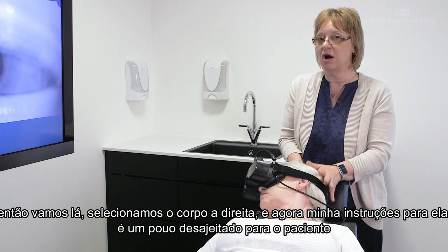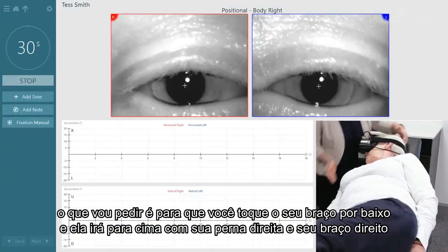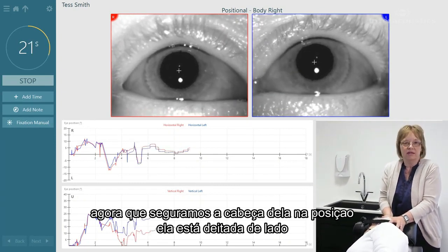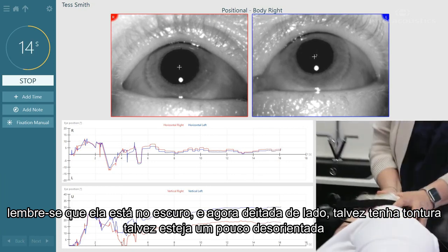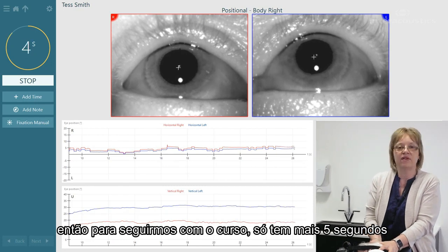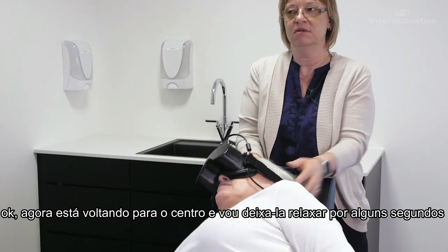Now my instructions to her — this is a little awkward for the patient, so you really want to help them through and make them feel comfortable. I'm going to ask her to tuck her right arm underneath and come up on her right leg and arm. I'll hold near her head — not holding her into position, but for support, just to let her know I'm here. Remember she's in the dark and now laying on her side; she might even be dizzy and a little disoriented. So I'm here for moral support, kind of bracing her head, and we'll let it run its course.